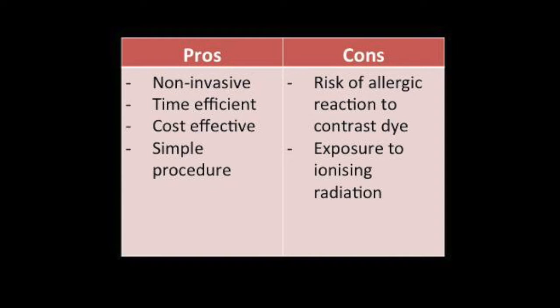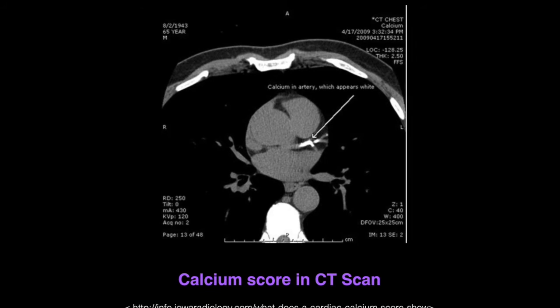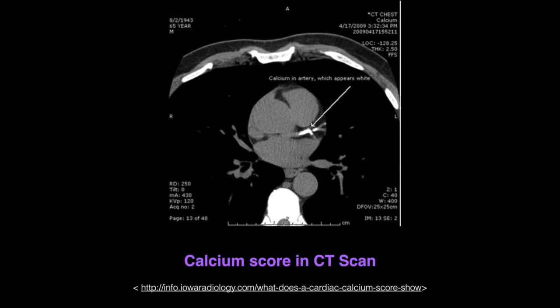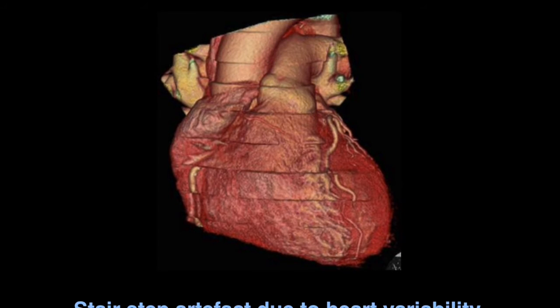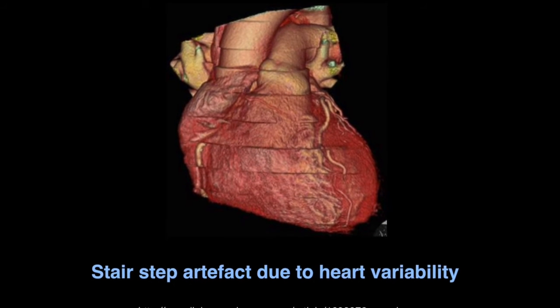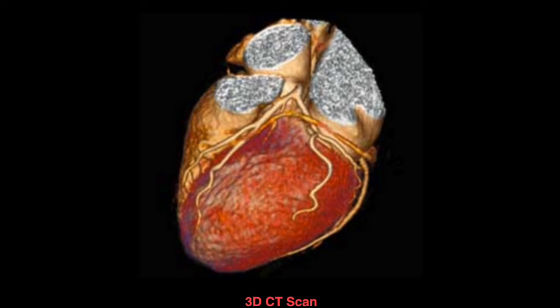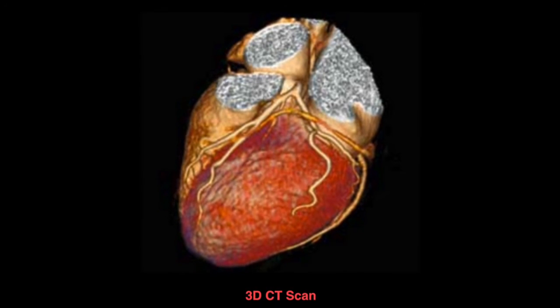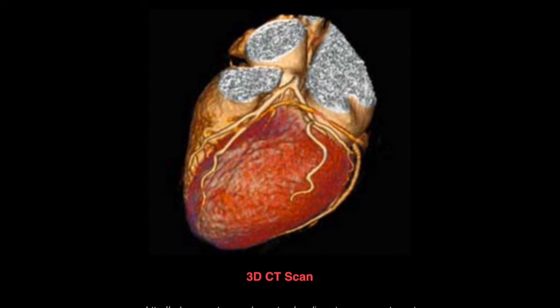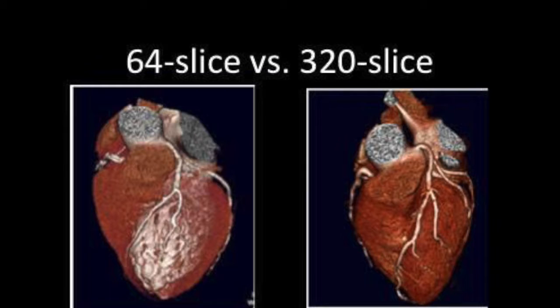Imaging of the heart has proven difficult in the past, as the contraction of the heart allows the production of motion artifacts. Hence, the shorter the time taken for a modality to image the cardiac region, the better. Issues arise with patients with arrhythmia, as CT angiography is preferable with those with a stable heartbeat and a normal breathing rate. A temporary solution which alleviates this problem is the oral administration of beta blockers, which help to reduce heart rate, in turn leading to an image with a more superior quality.